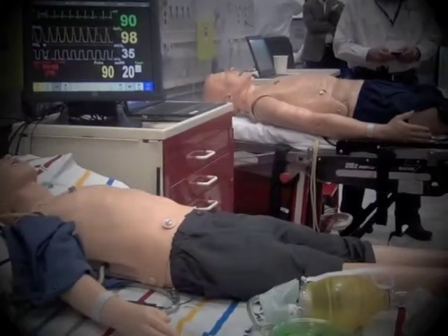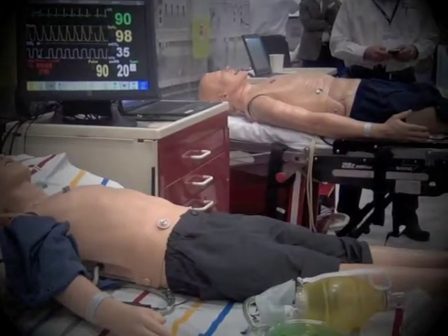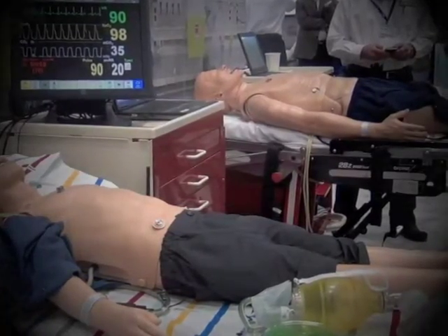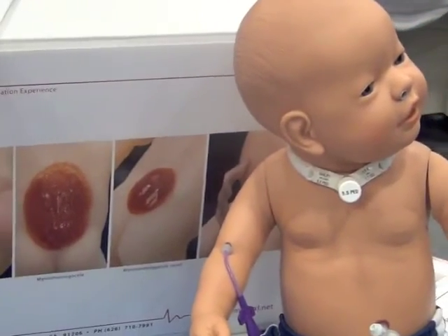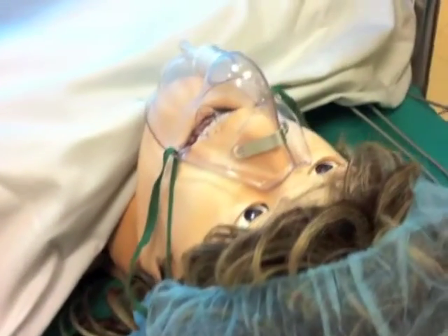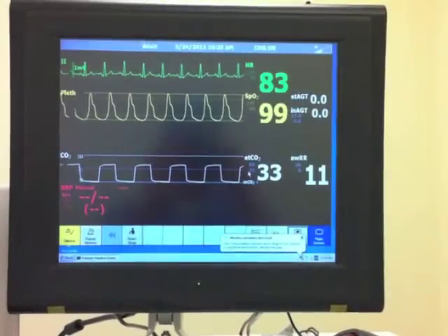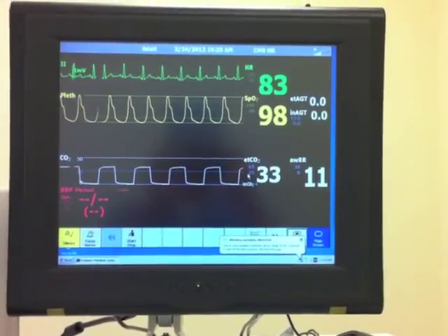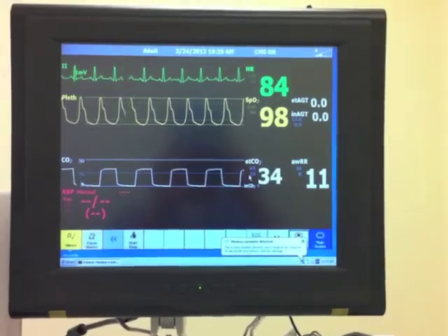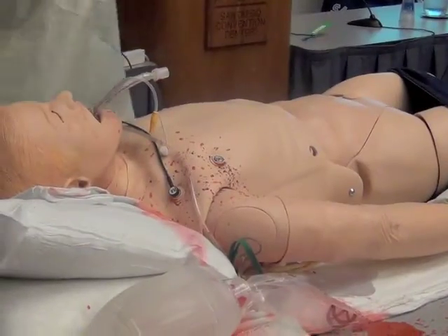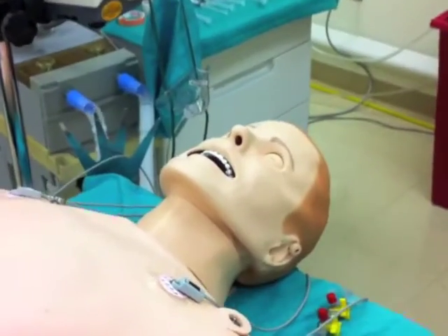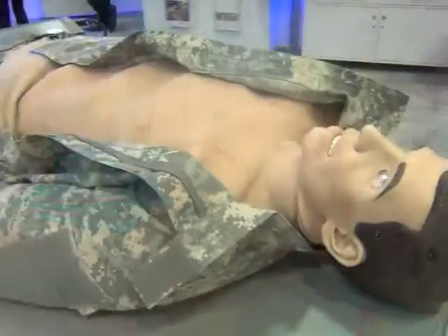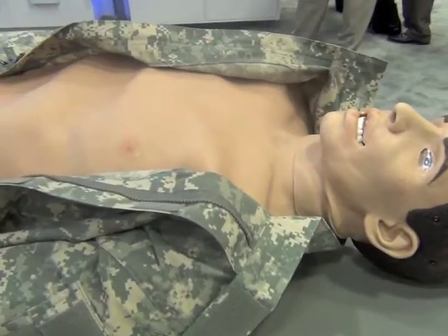Human patient simulators are mannequin-based simulators and vary greatly in size and features. Many models are capable of exhibiting vital signs and a wide variety of pathologies, including emesis, tongue swelling, pneumothorax, and variable heart sounds.